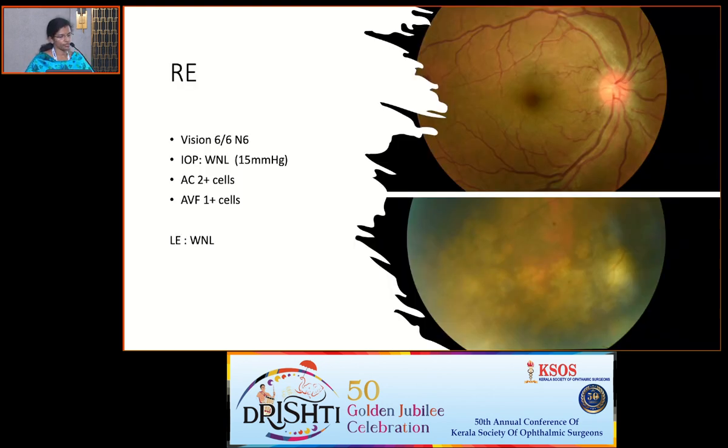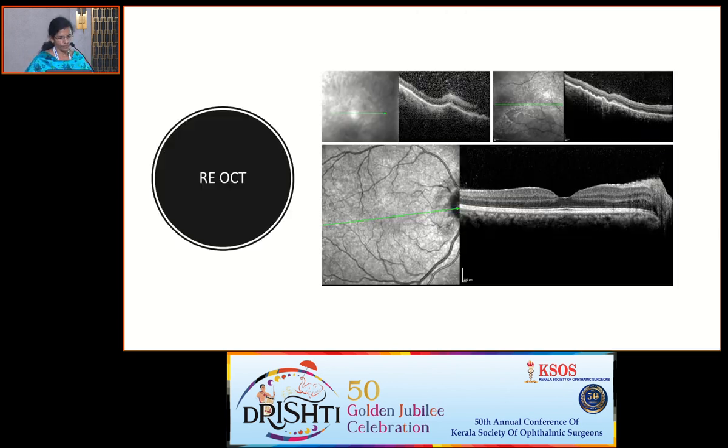Dilated fundus examination of the right eye. The posterior pole showed a hyperemic disc with blurred disc margins, and in the periphery, inferior, infratemporal and temporal quadrants, there were gray-white deep retinal lesions with obscured blood vessels over the lesion, showing a track-like pattern. There was a prominent lesion which was choroidal with normal overlying blood vessels, and we were able to make out a significant amount of vitritis over these lesions.